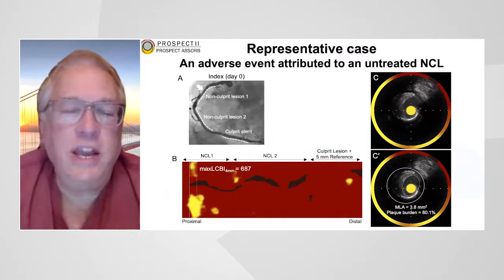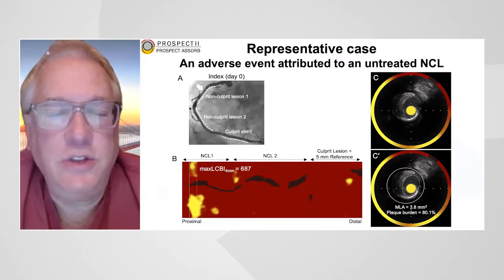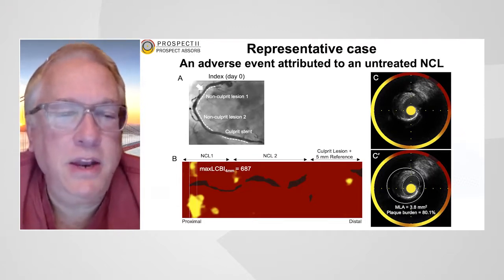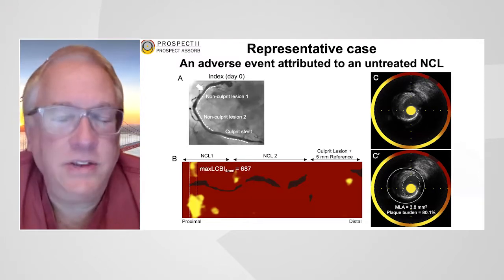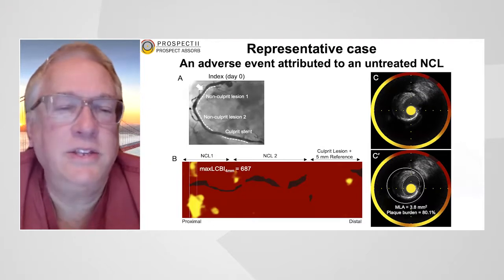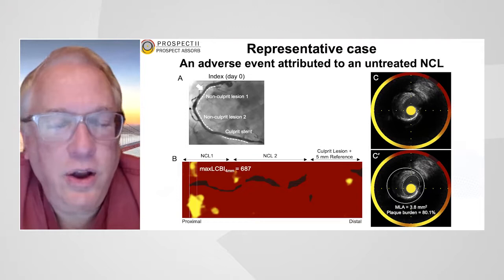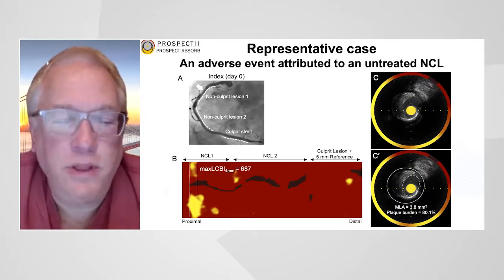So here, for example, is a right coronary artery, which was subtotally occluded. A stent was implanted distally, and you can see there's mild diffuse disease in the mid and proximal right coronary artery. By near-infrared spectroscopy, most of this is a non-lipidic vessel, except for very proximally at the site of the arrow, where there's a large lipid core, which is approximately 69% lipid over a 4 mm segment.